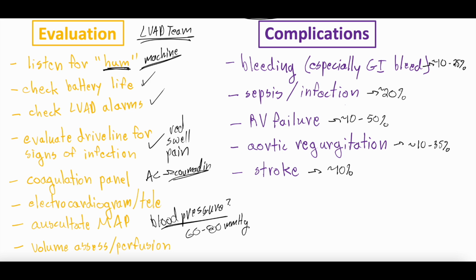Now, the blood pressure cuff sometimes will work. It depends a lot on what that patient's actual left ventricle is doing. But the LVAD itself is a machine, right? It's not pulsatile. It gets a little more complex, right? Because the HeartMate 3 does have kind of this pulsatility purge thing it does. But if you're trying to feel for a patient's pulse, you won't always feel one, even when they're doing just fine, because that LVAD itself is just sucking blood out and circulating it through. And that's just a constant flow, whereas the heart is squeezing, relaxing, which is how you get that pulse, right? Squeeze, relax, squeeze, relax. This is pulse, nothing, pulse.